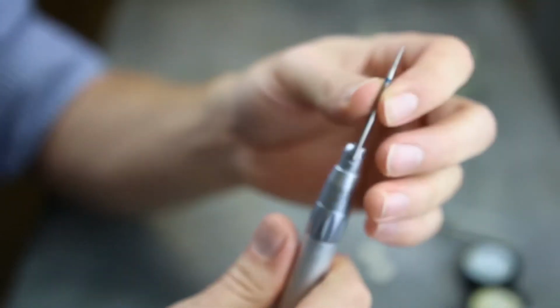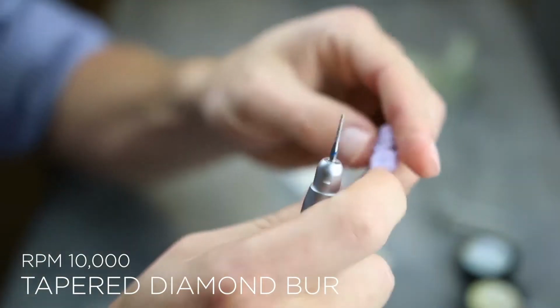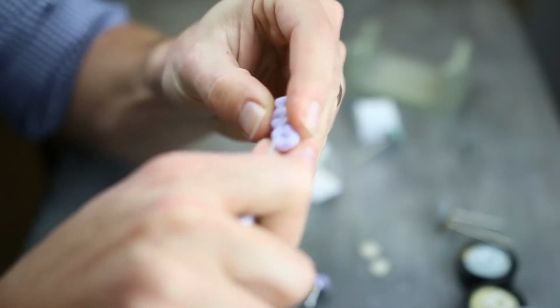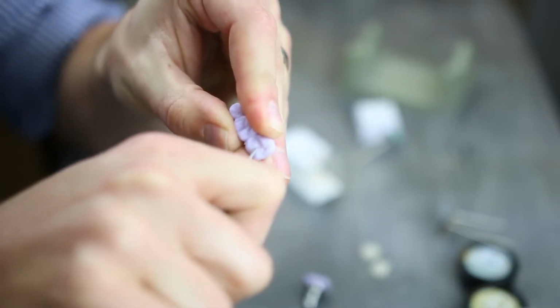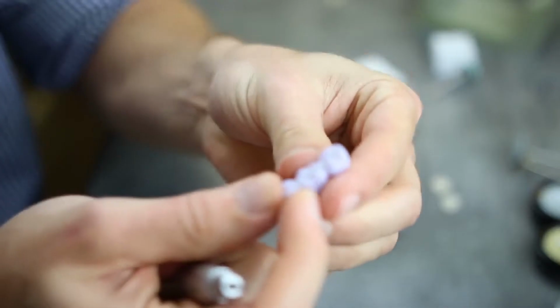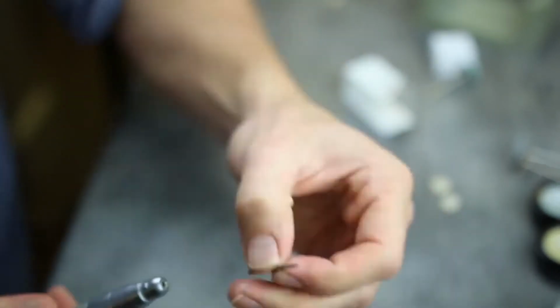Now, when I'm increasing the anatomical features of a restoration, I really like to use straight lab diamonds. I feel like they're a really great addition to the practice. You can use your dental high-speed handpiece if you'd like. Because this restoration is going to go through the furnace afterwards, you don't actually need to use water at this point. It's different if you have a restoration that's already been through the furnace, because you don't really want to be touching a finished restoration with a diamond. That could cause fracturing and problems, especially without water. So I sometimes move from one to the other with these lab diamonds.